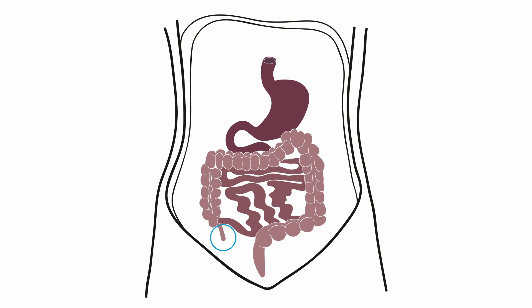A normal appendix has a subtle wall and a small diameter under 6 mm. It's also a mobile structure and can shift under pressure from a probe. When the appendix is inflamed, it becomes dilated and attaches itself to the other abdominal structures. The surrounding fat structures show stranding, pinpointing the pathology and pointing you directly toward the inflamed appendix.